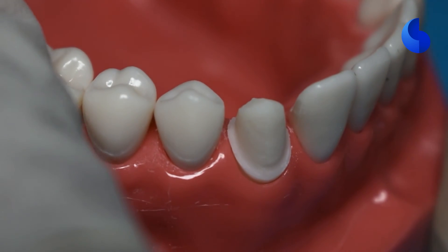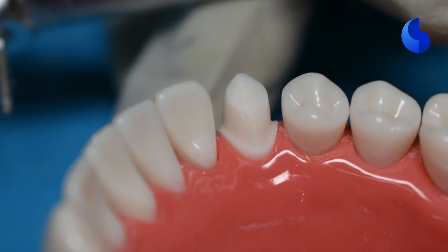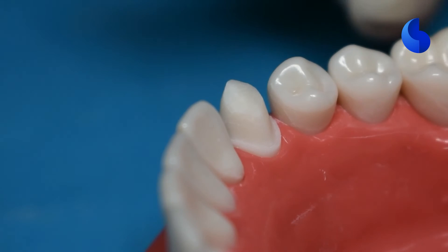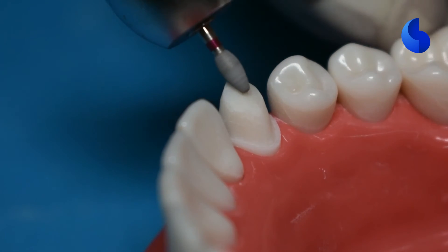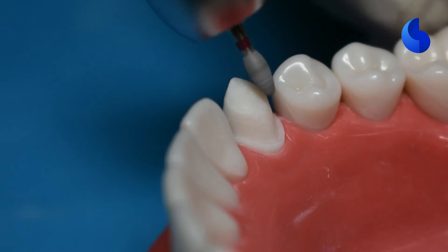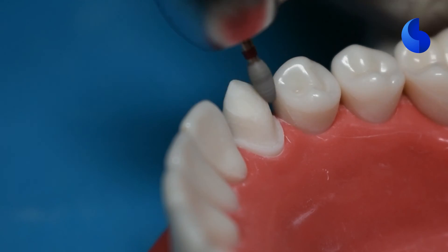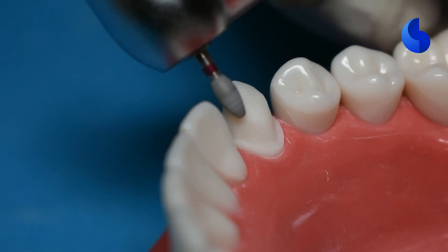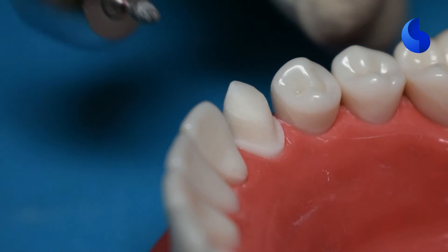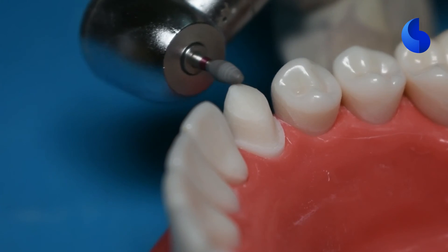After all our refinements, take a look at your preparation to make sure that you have an even width of one millimeter all across. Once you have that, refine your lingual surface — there's a ridge that runs on it with two canine fossas on either side. To bring that into your prep, use a football diamond to reduce the surfaces on either side of your lingual ridge. Be very gentle and remove tooth structure on either side of this ridge while smoothing out and rounding all the sharp edges you may have created during preparation.